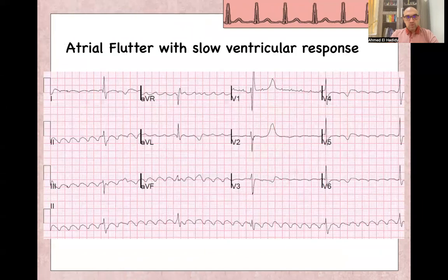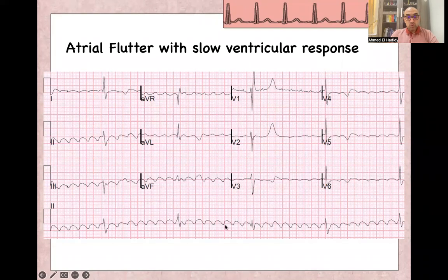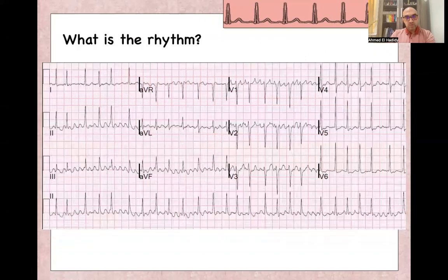There is also atrial flutter with a slow ventricular response. In this ECG, the heart rate is around 30 beats per minute with flutter waves very obvious — usually seen when the patient is already on medication like a beta-blocker or has digitalis toxicity.